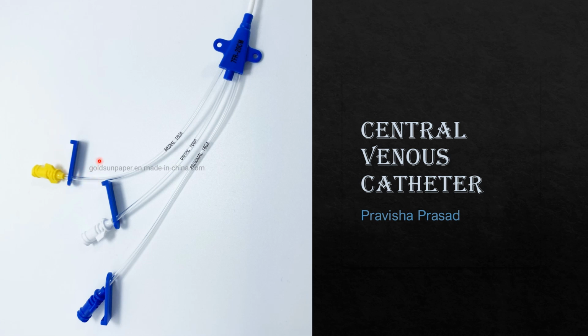So why is this specifically used for TPN administration? Because if your patient is on fluids or in fluid resuscitation, you can also give TPN. If you administer it through the medial port, TPN has no interaction with these fluids. That's why we administer TPN through the medial port.